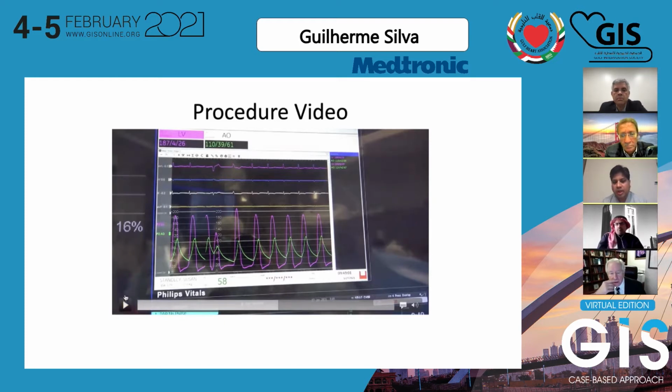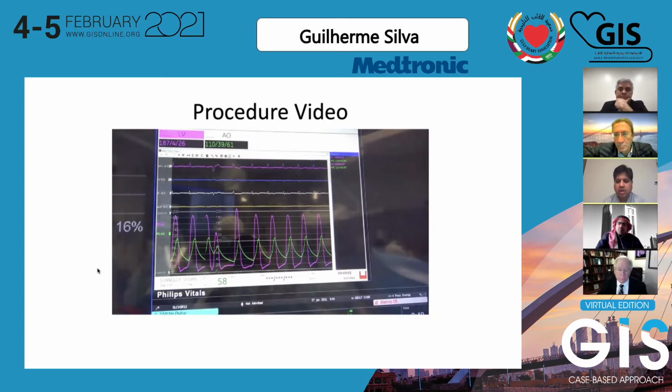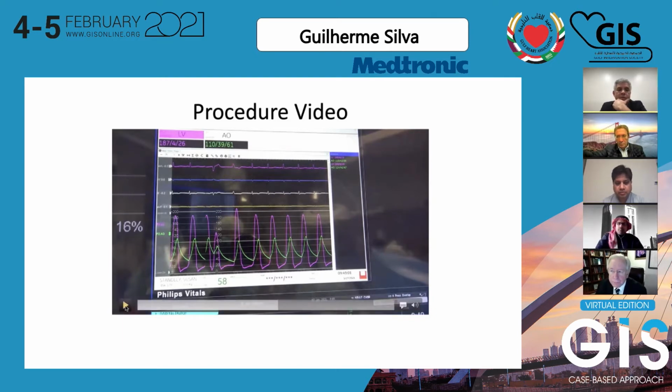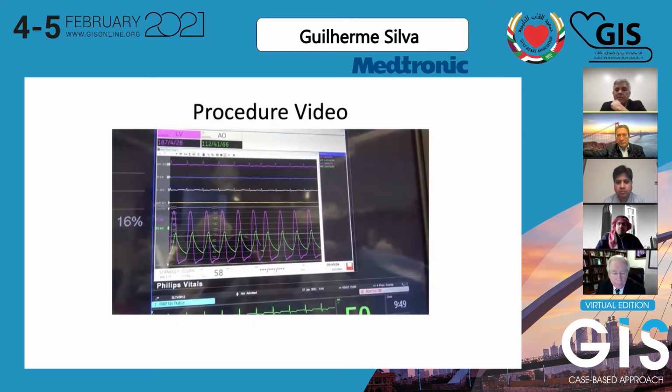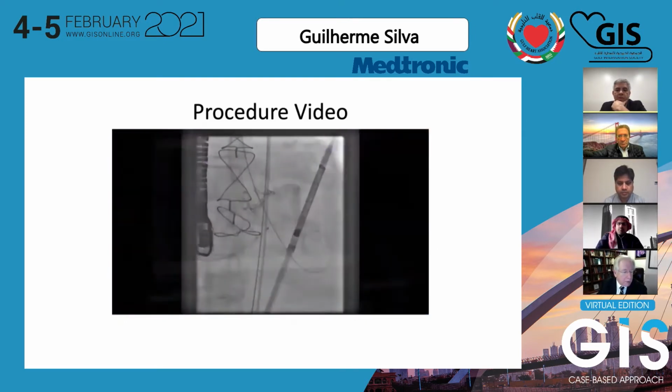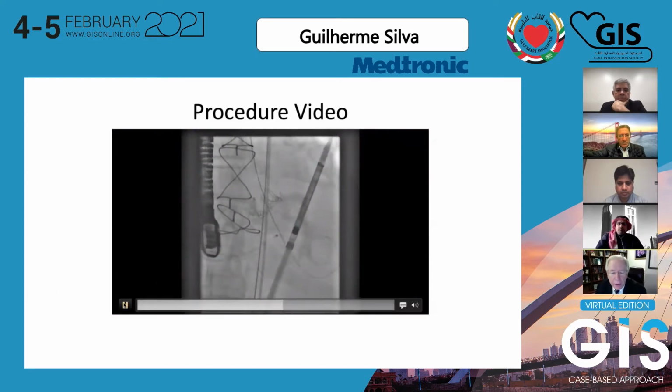What happens is when you're leaving another valve inside, the bioprosthetic leaflets can potentially close the low originating coronaries. Those are the things we look for before Dr. Silva, Dr. Coselli, and Dr. Simpson go ahead and deploy it. Go ahead, Dr. Silva. Okay, so the gradient was quite significant. Dr. Coselli, can you hear us? I can hear you, yes.